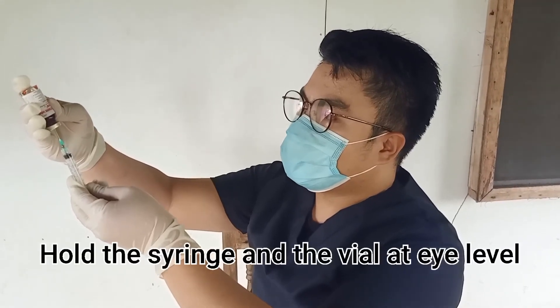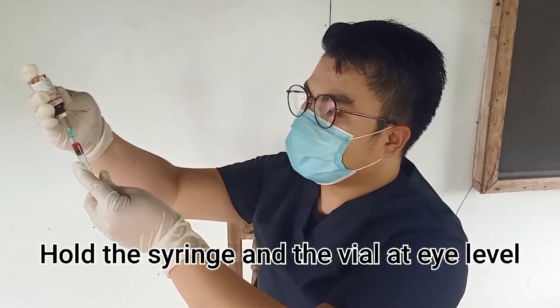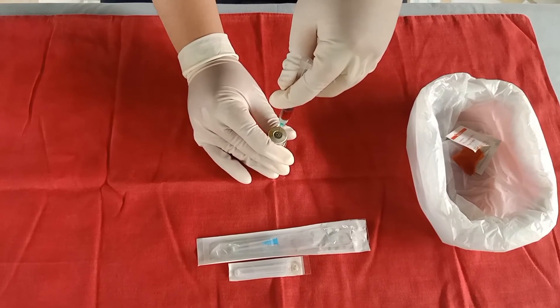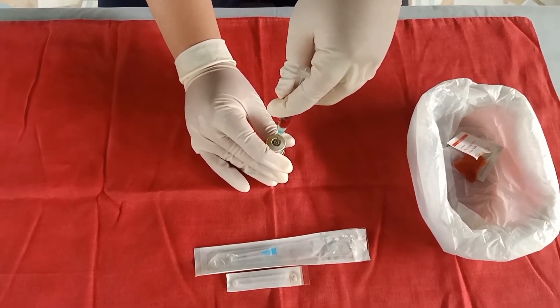I will be withdrawing 1 cc of the medication. When the correct volume of the medication is obtained, withdraw the needle from the vial and replace the cap over the needle using the scoop method, thus maintaining the sterility.